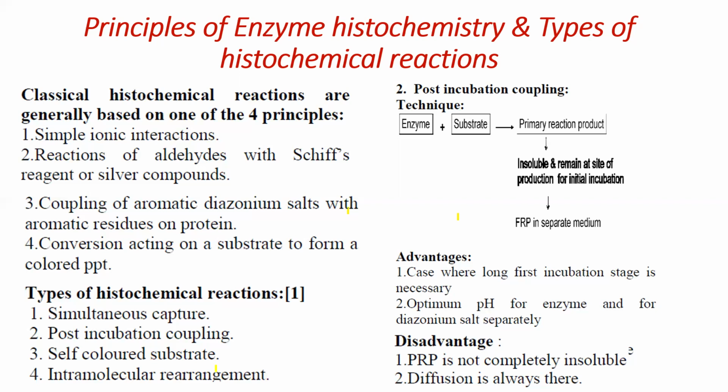For an enzyme histochemistry test, it will take around 500. So there is a drastic variation in the lab cost. In any small primary healthcare or simple government hospitals, we will try with enzyme histochemistry only rather than FACS analysis. The FACS machine is very costly. That is one reason.